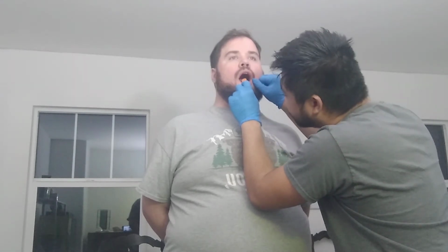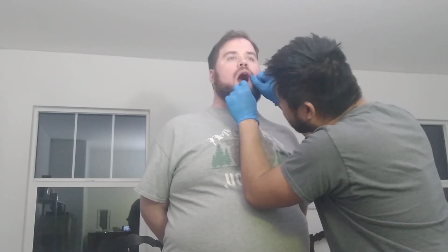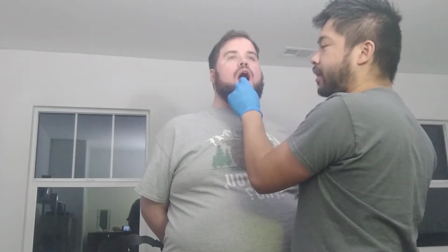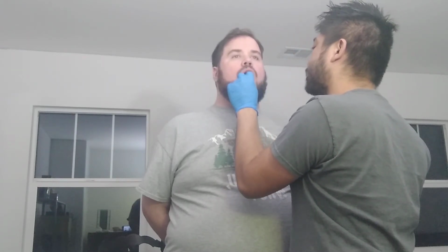And then with my pen light, I would be illuminating the more internal structures of the mouth. So I'm looking at the palate of the mouth. Okay. Palate of the mouth looks good. There's no breaks in the palate. No lesions or discoloration noted in the palate or the membranes or the gums of the mouth.